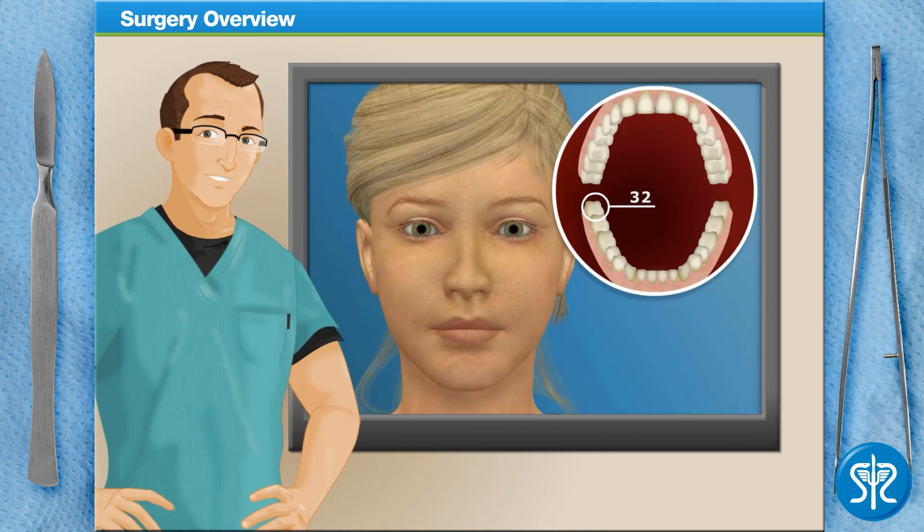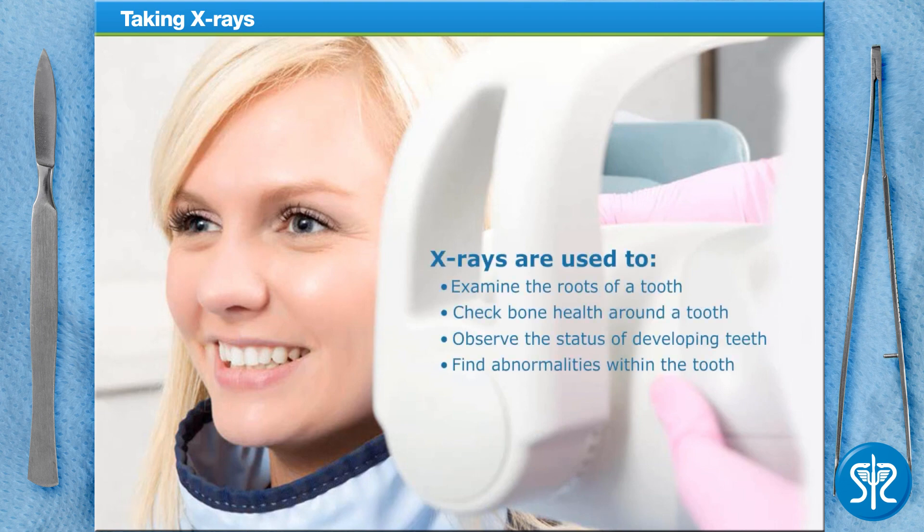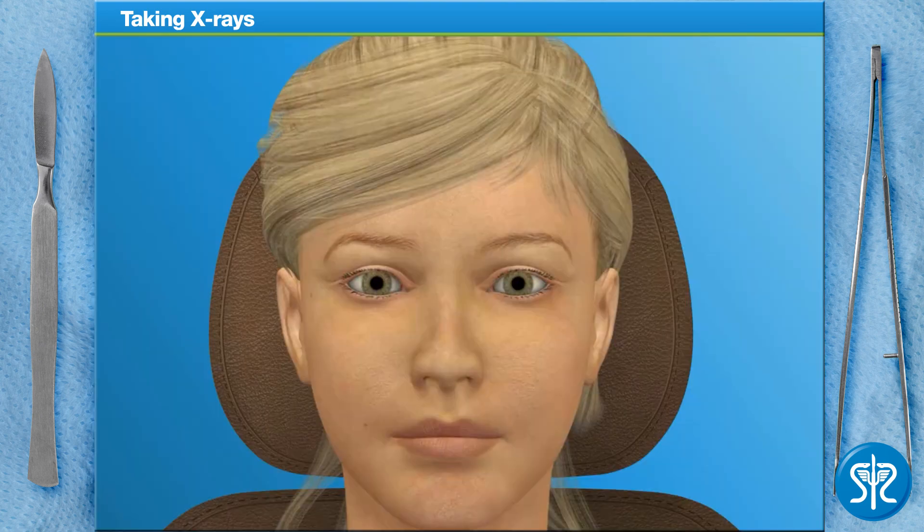Before we begin, let's get some x-rays taken of our patient's teeth. X-rays, or radiographs, are essential, low-cost diagnostic tools used to examine a tooth's roots, check the health of the bone surrounding the tooth, observe the status of developing teeth, and locate abnormalities. Let's get started.